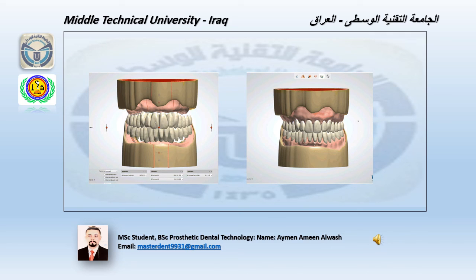Arrangement of artificial teeth. The software of this system has different sizes of artificial teeth and different forms. We select the appropriate size depending on the case. After complete setting, we do virtual waxing using the software of this system by using the wax fabrication option.